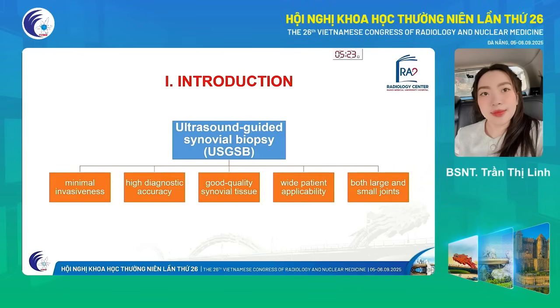for the same joint. Plain needle and fluoroscopic guided biopsy are more difficult to conduct in small joints and joints without active synovitis, and have a lower success rate for obtaining synovial sample than other methods. Cost and technical simplicity favor plain needle biopsy, while suitability for serial biopsy and biopsy in small joints favor USGSB. Compared with arthroscopy biopsy, USGSB is less invasive and can be conducted in both large and small joints.